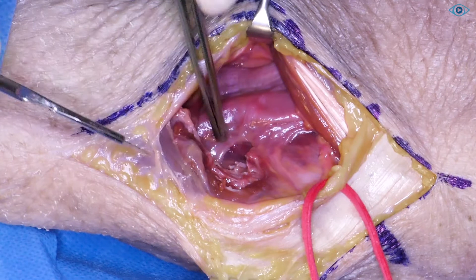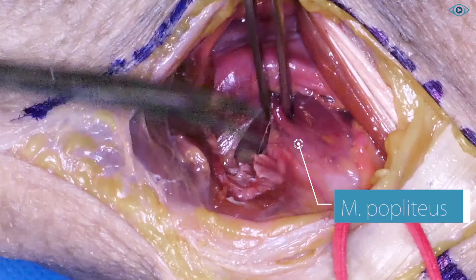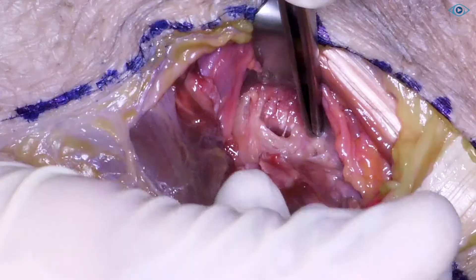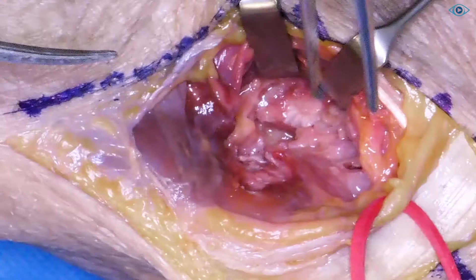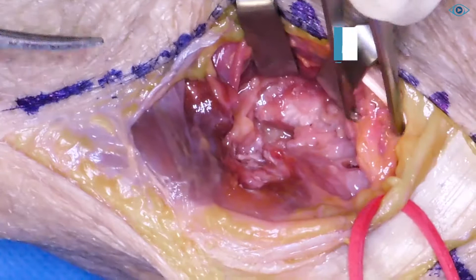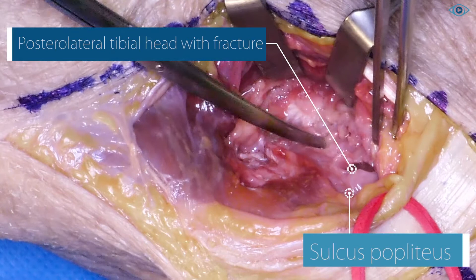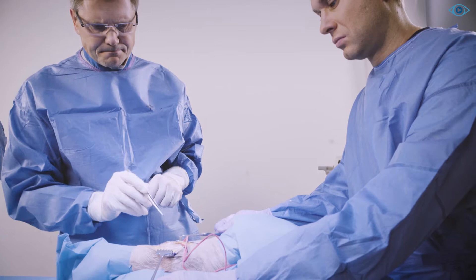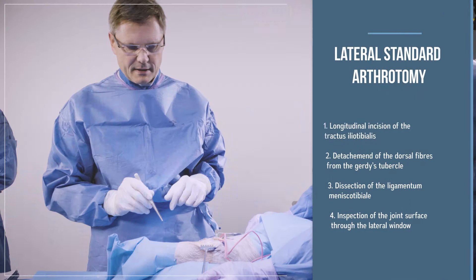Here we are already approaching the posterolateral tibial plateau. Now we can cut the lateral inferior genicular artery. Here the popliteal muscle can be seen very well — it can be incised a bit at the distal end. Now we start to see the fracture right here. There's still periosteum on it. Small ligaments at the head of the fibula can be cut in order to display the fracture better. We are now holding the popliteal muscle aside, and we can see the popliteal groove here on the upper edge. Here is the fracture — we are looking right at it. It is a very thin, osteoporotic fracture. Here is the posterolateral plateau, which is stable. The peroneal nerve and vessels are held aside. Now we are facing the challenge of one central impressed fragment, which is about 2 cm in depth. We can hardly see and reduce it from here. That's why we now need a lateral window.